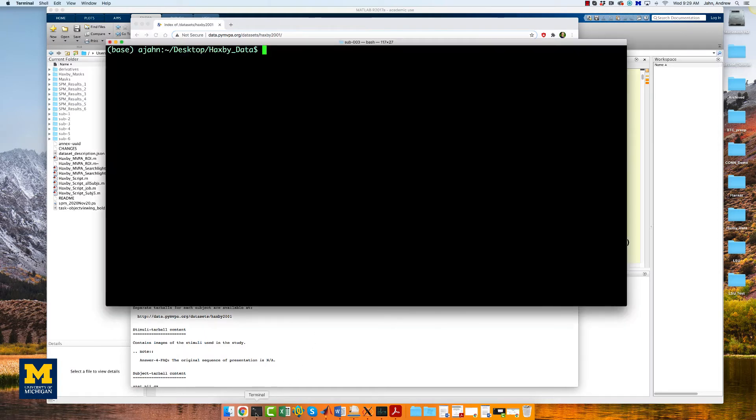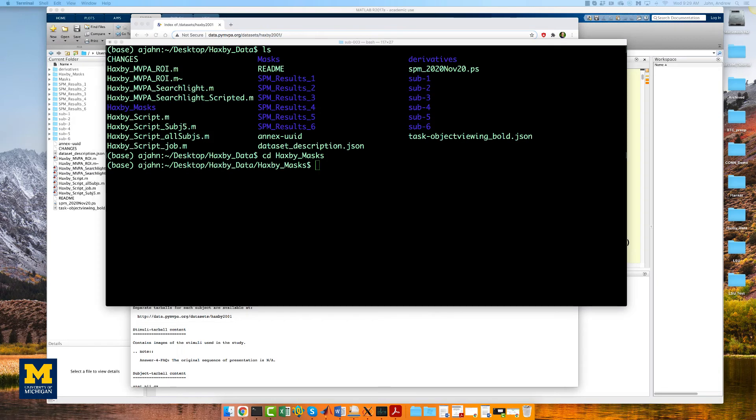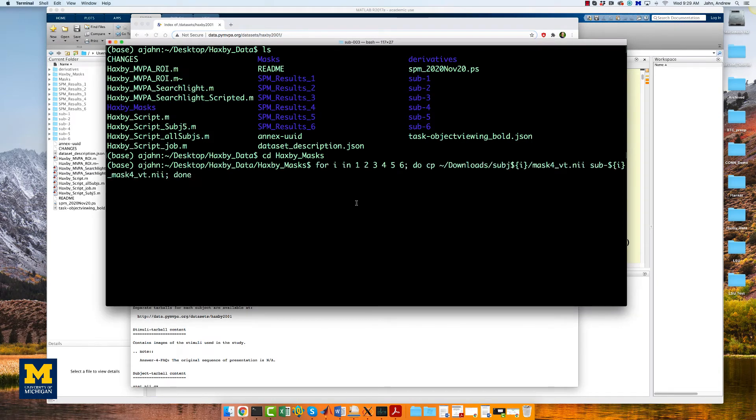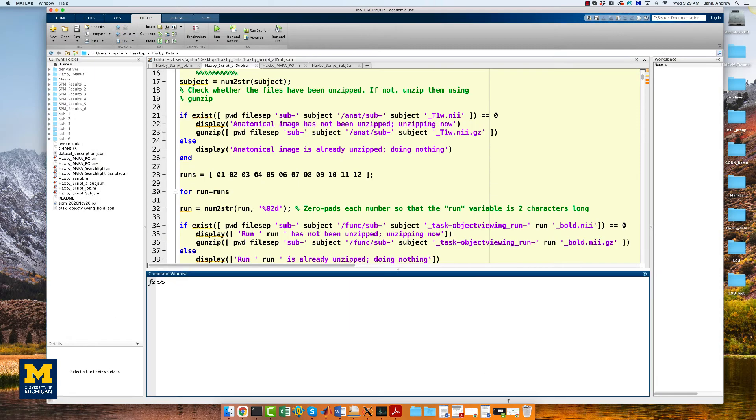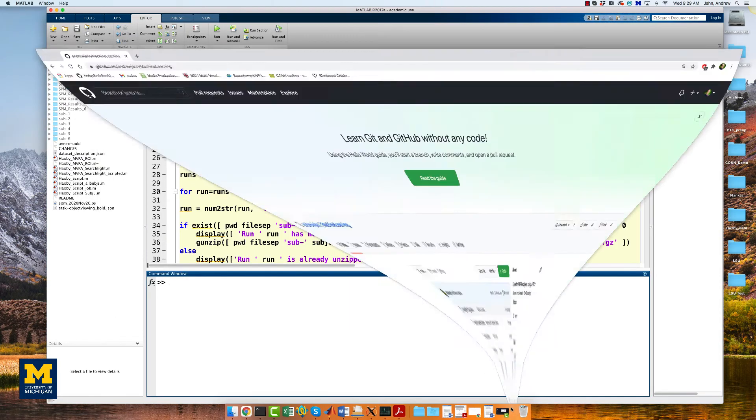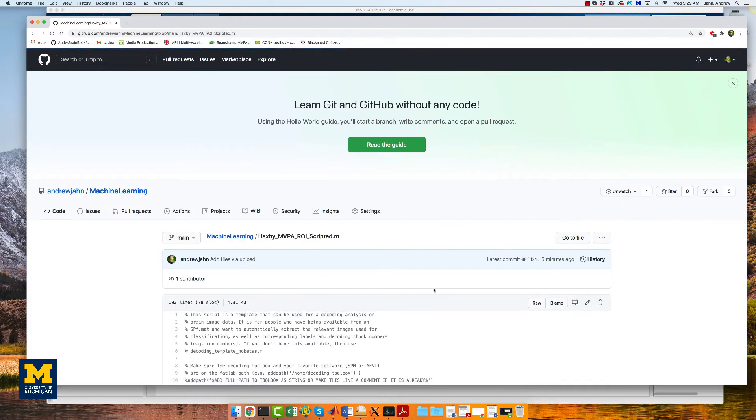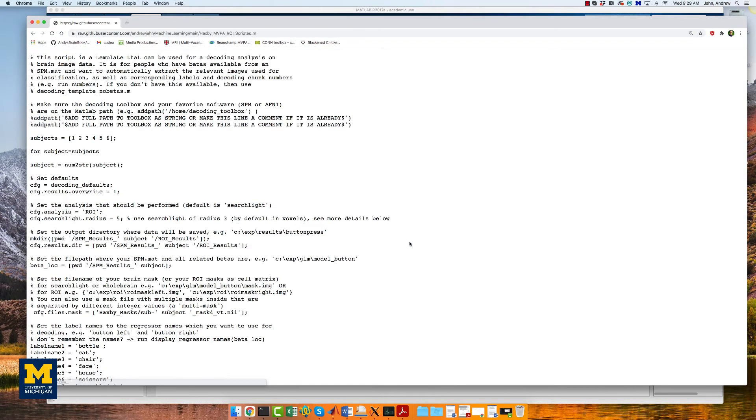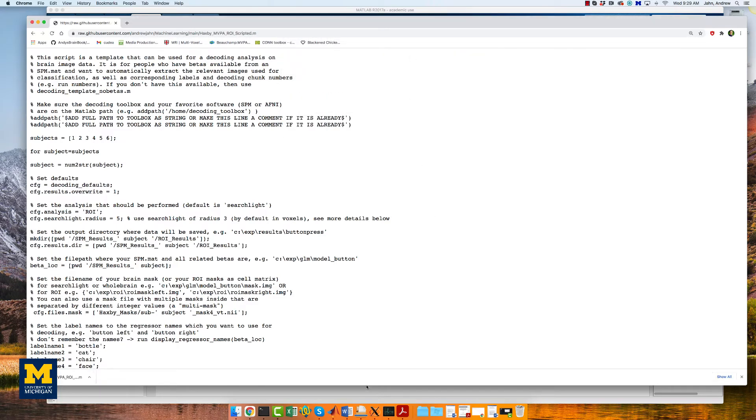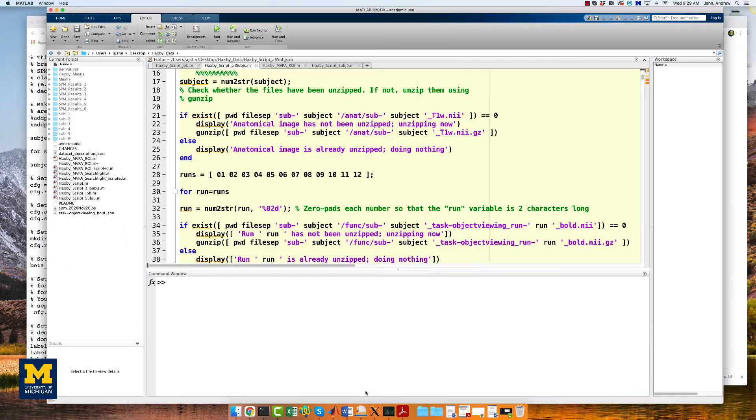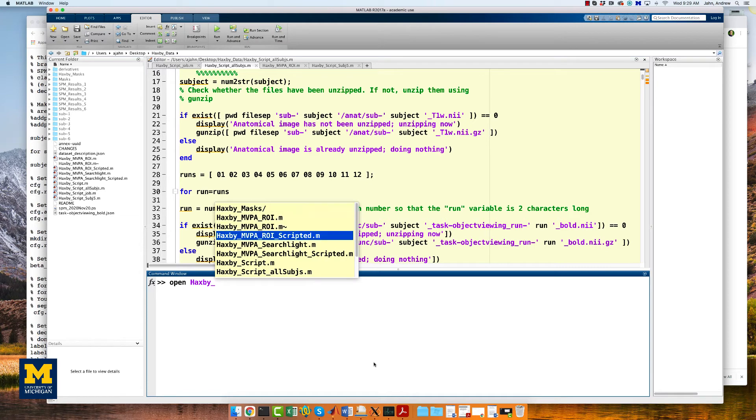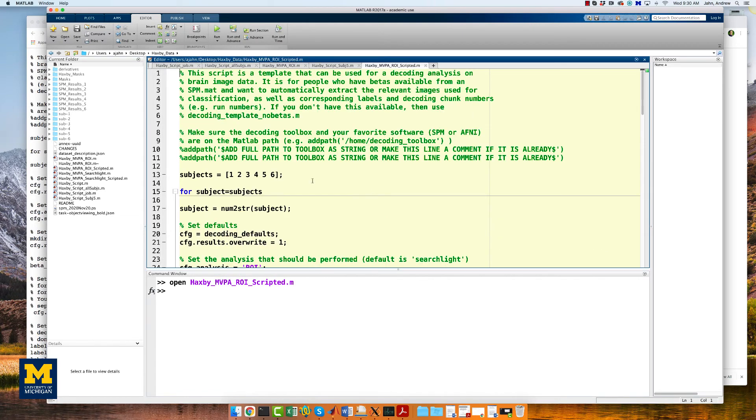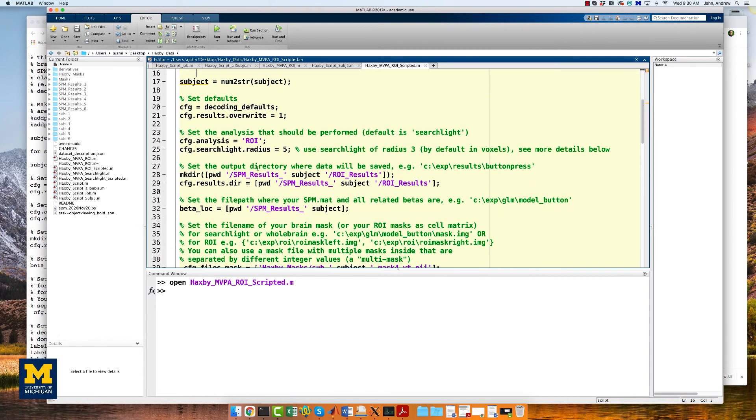Once you've done that, open up a terminal and copy and paste the code in the more info box down below. Go into the Haxby masks folder, then copy and paste the for loop, which will put each subject's mask within that folder and label it according to the subject number. When that's done, go back to the GitHub page and download the file Haxby MVPA ROI scripted and save it to the Haxby data directory. When it's downloaded, go to the MATLAB terminal and open up the file.